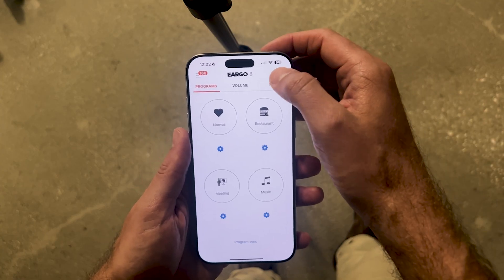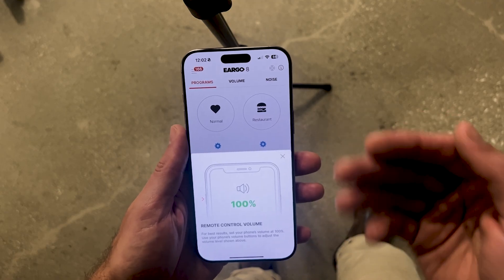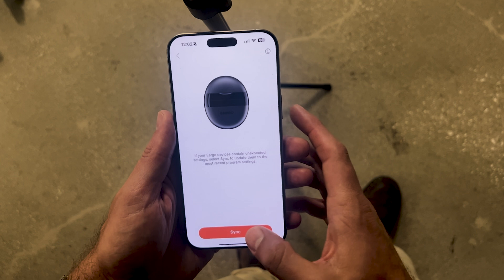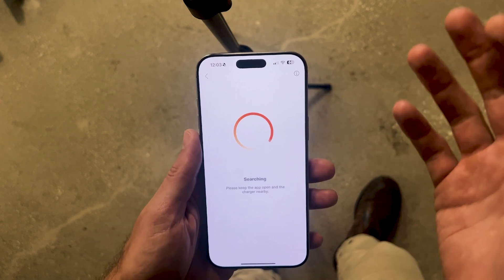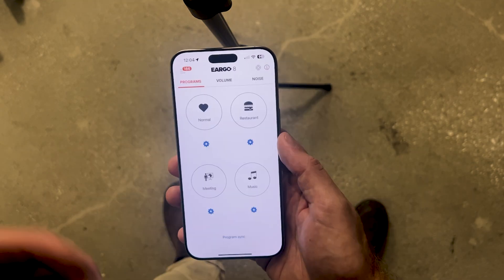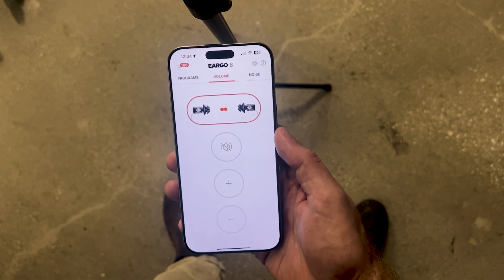A few other things to know about the Eargo app: if you tap the circle icon in the upper right, it will tell you the volume your phone is at any time, which is helpful if you're not getting a response when you click things — remember, the volume needs to be at least 60%. It's also worth noting that you can do a program sync, which essentially takes your hearing aids back to the programs they were at a few minutes ago. So if you make a change you don't like, hit program sync and it will revert your hearing aids back to where they just were.